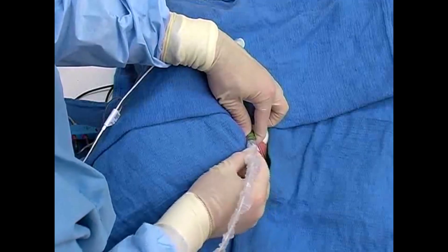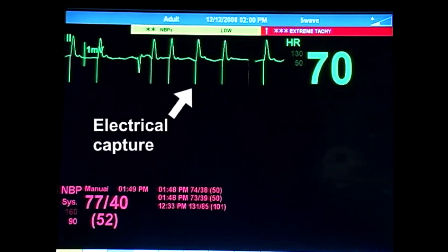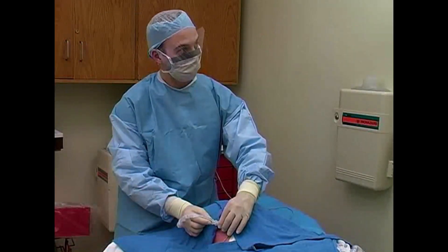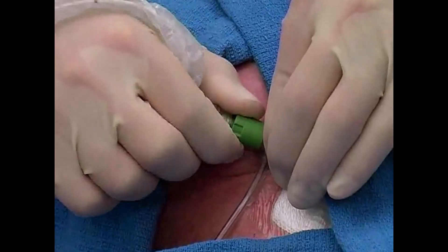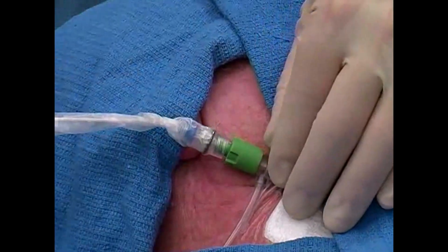Continue to advance the catheter. Your goal is to bring the tip of the pacing wire into direct contact with the trabeculae of the right ventricular endocardium. Once this occurs, you will see electrical capture on the EKG tracing. Capture is signified by a wide QRS complex occurring after every pacing spike. Once capture has been achieved, advance the catheter another 1 to 2 centimeters to firmly seat it against the right ventricular wall. Finally, deflate the balloon. If your sheath introducer has a closable valve, tighten it by turning it clockwise to secure the pacing wire in place.